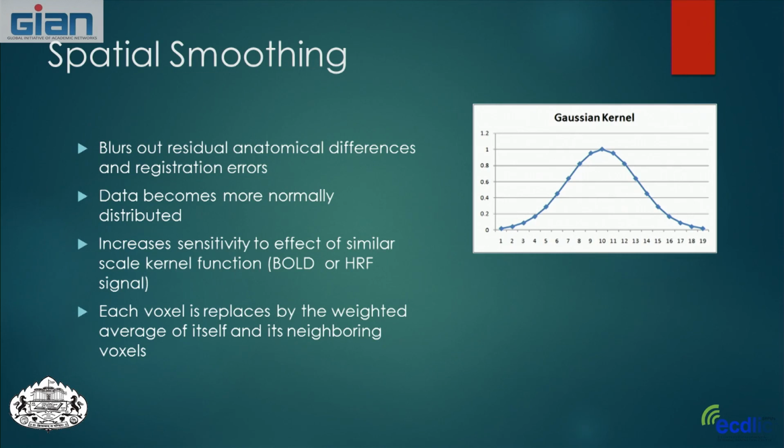Now, I worked with a guy that just hated spatial smoothing. He thought it was like the worst thing to do to the data. You're trying to spatially localize where you're seeing activation, but you're smearing it all around first. So there's definite advantages and disadvantages to doing this. People will smooth these over between 4 to 8 voxels. So that's quite a bit of smoothing.